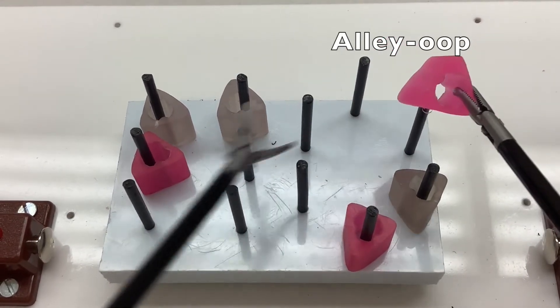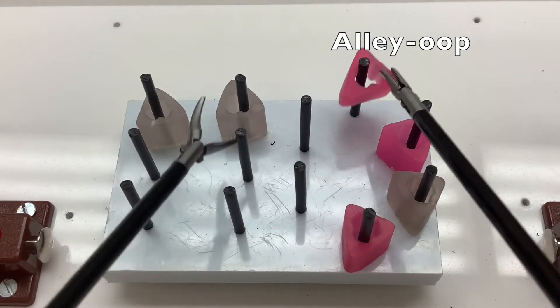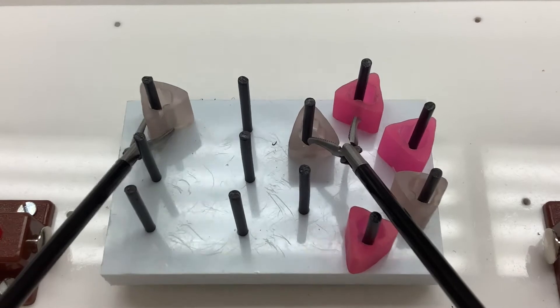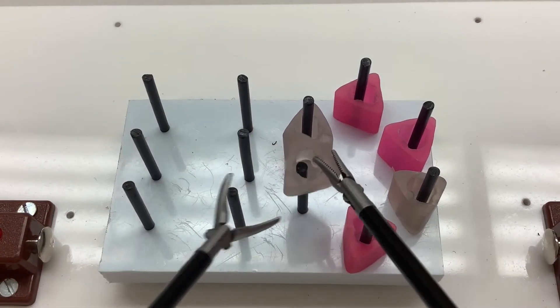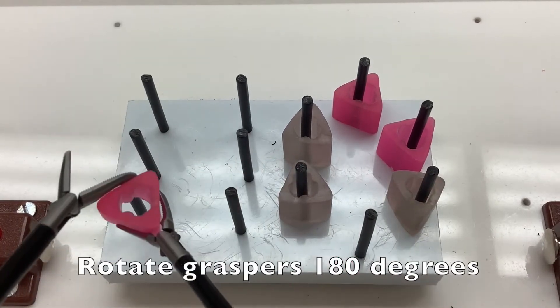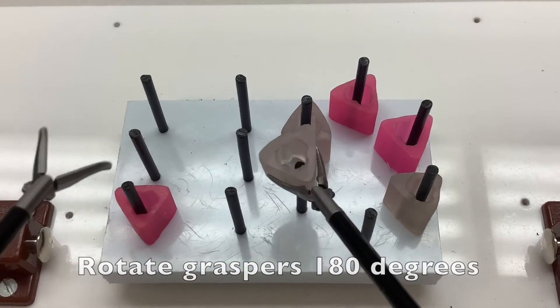The receiving hand then needs to only dunk the object over the peg and then moves to the adjacent peg. This enables the examinee to focus on the transferring hand, which promotes the simultaneous use of both hands and maximizes efficiency. After the first set of transfers, we rotate the Maryland Graspers 180 degrees and repeat the process.